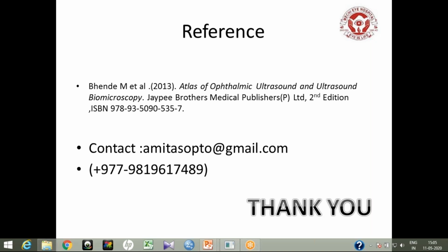Yes, Kapil. In case of OGI, we generally postpone the B scan. I suggest not to do the scan.